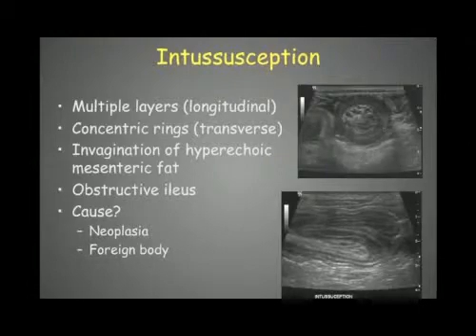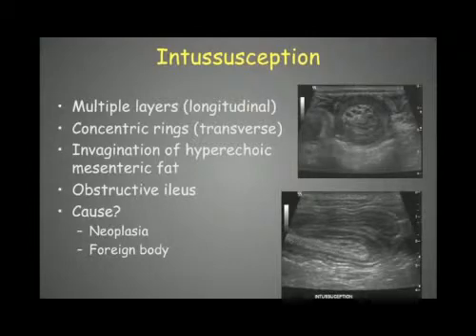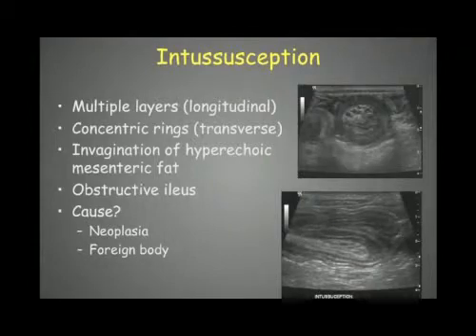There is also an invagination of hyperechoic mesenteric fat together with the intussusception. This hyperechoic fat is visible here. We can see the loop on the outside and the loop on the inside, with the mesenteric fat also situated within that loop.